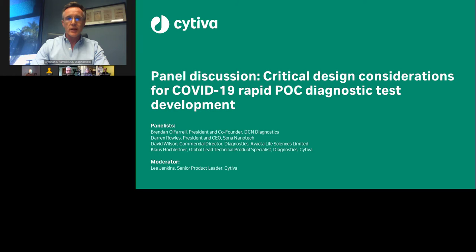in the context of pregnancy testing or HIV testing or strep throat testing at the doctor's office, but has been applied as a very mature technology in literally hundreds of applications over the course of the last 30 years or so. So there are two primary applications of the immunoassay in the context of the pandemic. I suppose there's antigen detection and antibody detection.